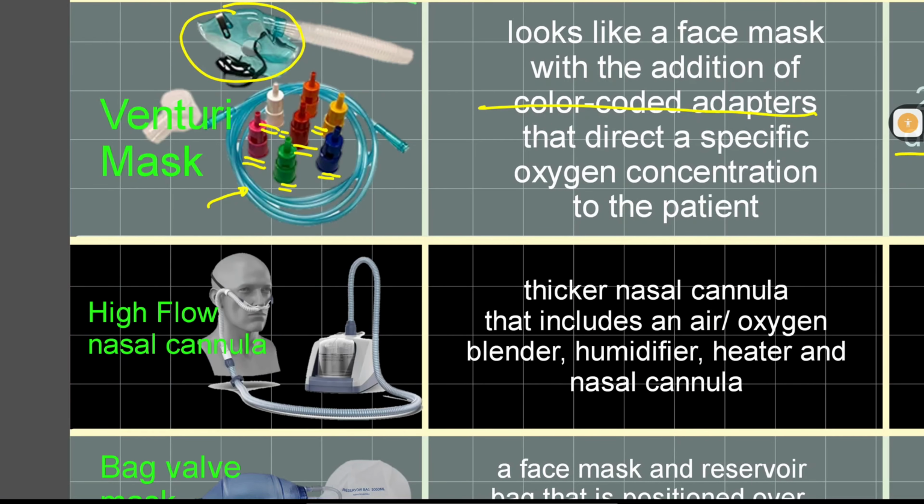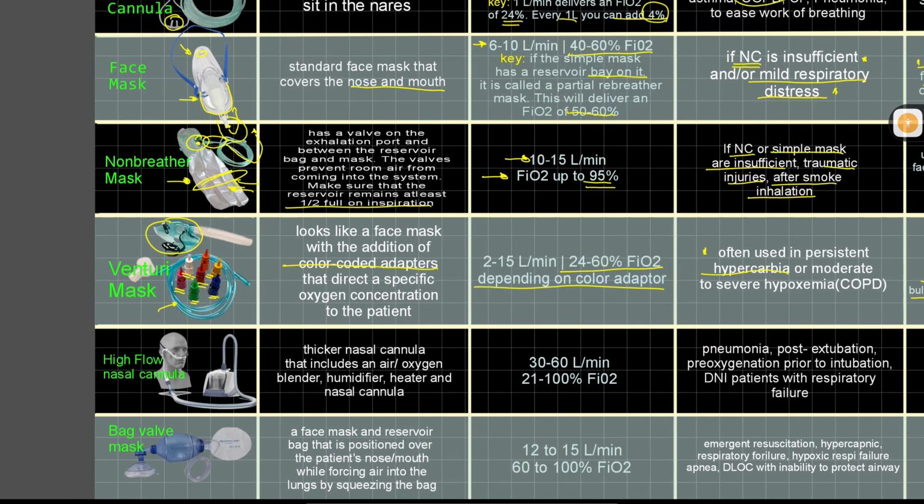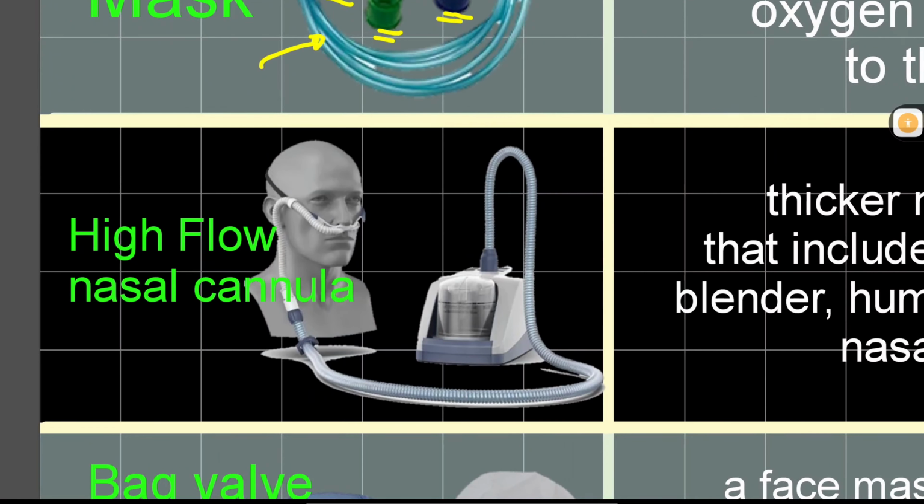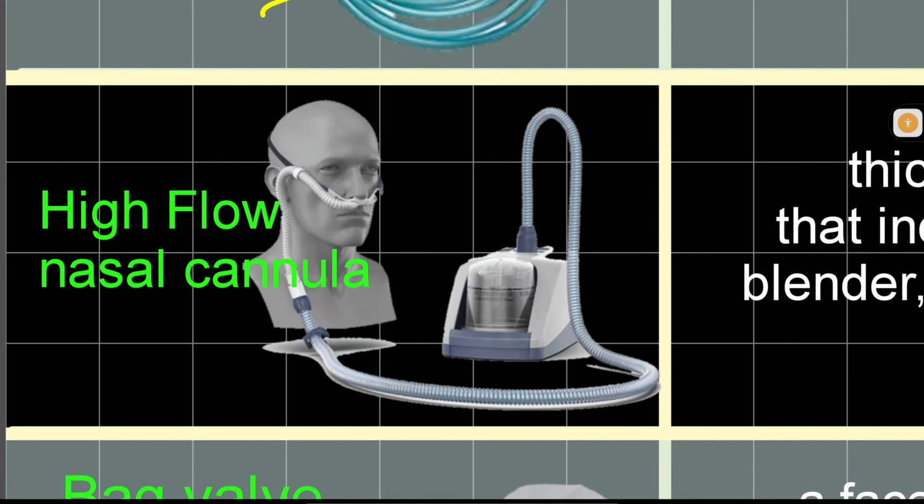Okay, mag-move on na tayo. So, the next one, nakakailan na ba tayo? Nakakalima na, no? O, panglima na pala to. So, we have here your high-flow nasal cannula. If you haven't seen one, this is how it looks like.